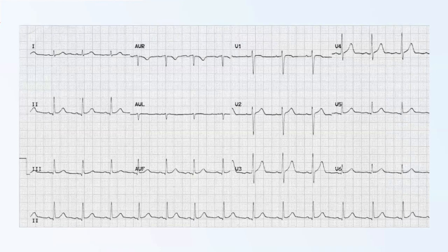So this ECG is just to show you a normal ECG. You can tell it's a sinus rhythm because there are upright P waves in leads 1, 2, and aVF. These are the leads that look at the left bottom side of the heart. In the video you saw before, as the impulse travels from the SA node downwards towards the apex of the heart, it travels in that direction.